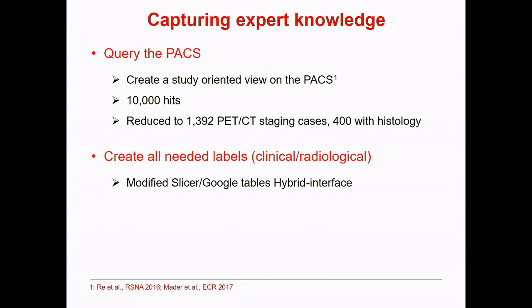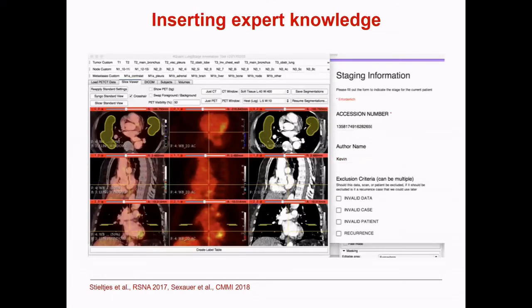What I expect out of such an exam is an exact tumor formula. There's a system called Tumor, Nodes and Metastasis, TNM, that uniquely describes the current situation of a tumor before the treatment. This is what I require to do my treatment decision making. We looked at about 400 cases of this, and when we looked at the reports, which we could easily draw, in only 5% or so of all the reports was the TNM explicitly named.